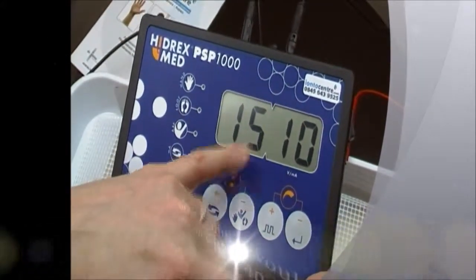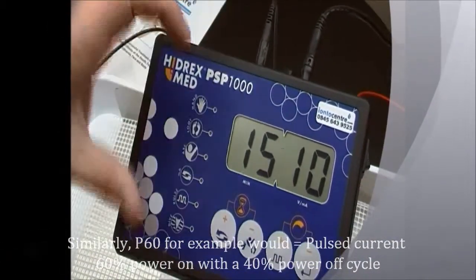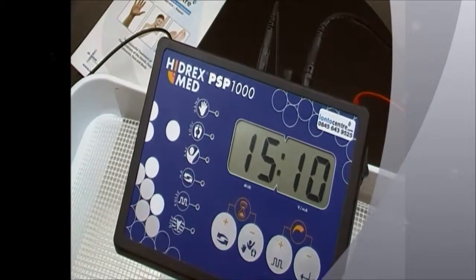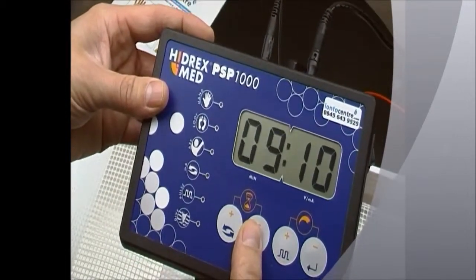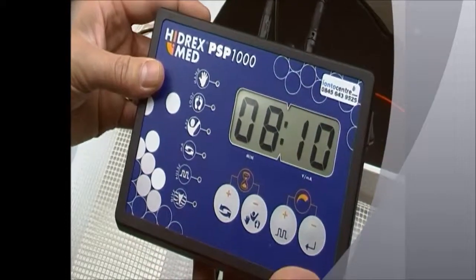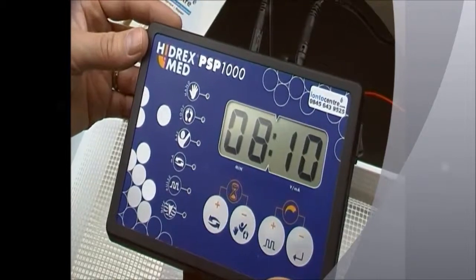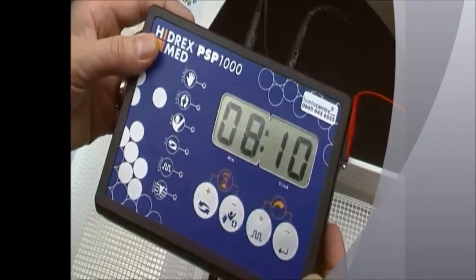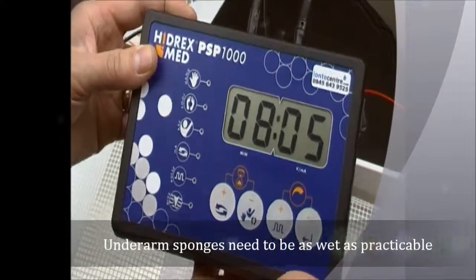This machine is now in direct current manual mode, with 15 minutes on the timer and 10 on the power. If we're treating the underarms, instead of one 15-minute session, we recommend bringing the time down and performing two eight-minute sessions. That allows you time to re-soak your underarm electrodes. If it's first-time use, bring the power down as well to something quite low.